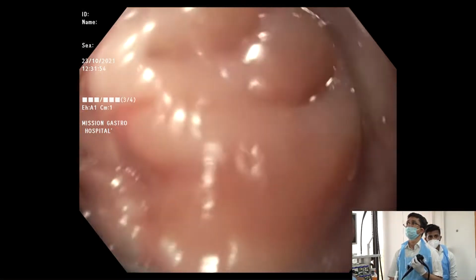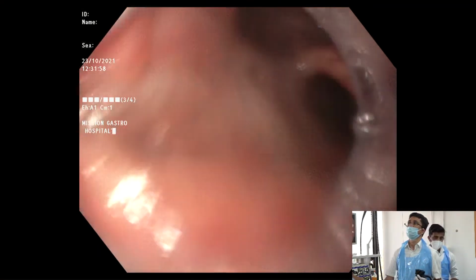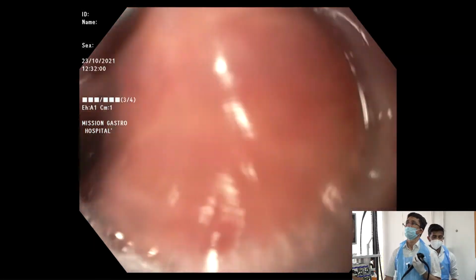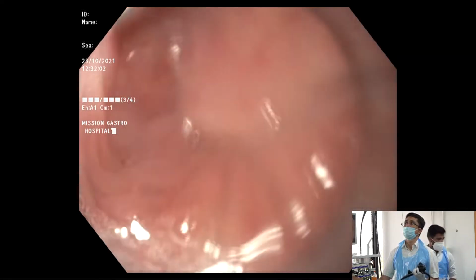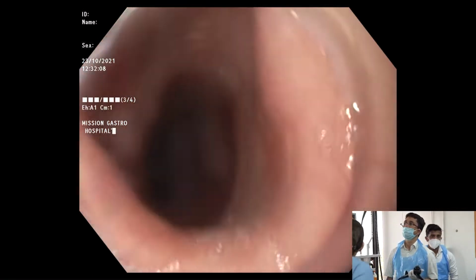Okay, so you're going to tell us where is the lesion, all right? And tell us what is the Paris, what is the Japanese classification, what is the type of lesion?